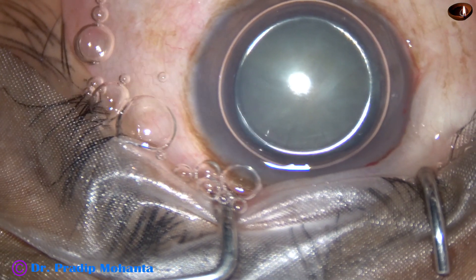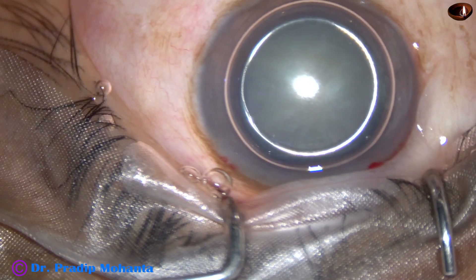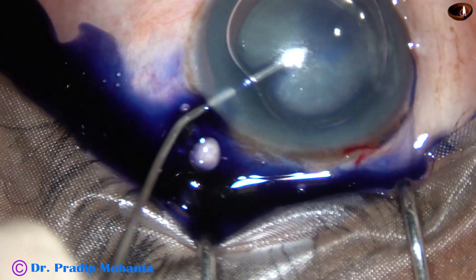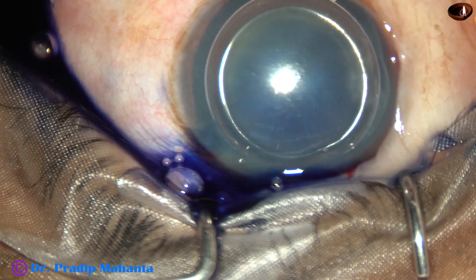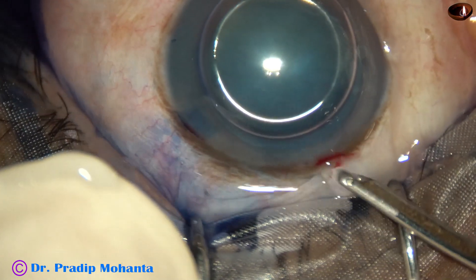Now an air bubble has been injected and here goes trypan blue dye underneath this air bubble to stain the anterior capsule of this white cataract. The dye is then washed out.